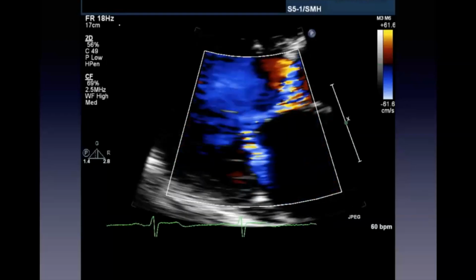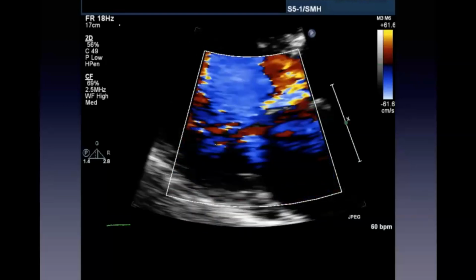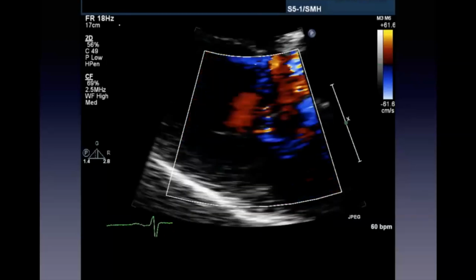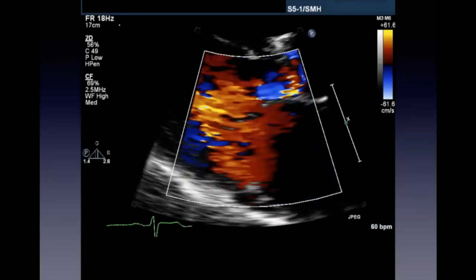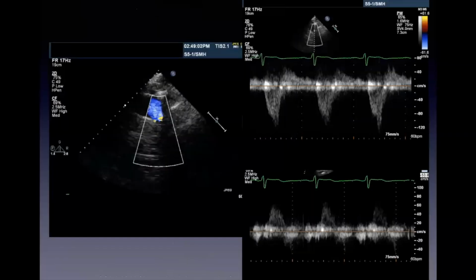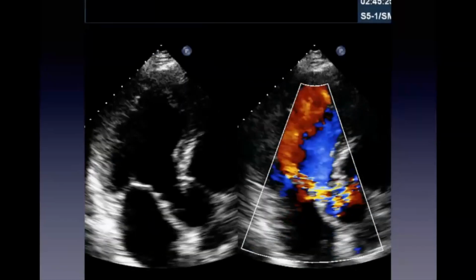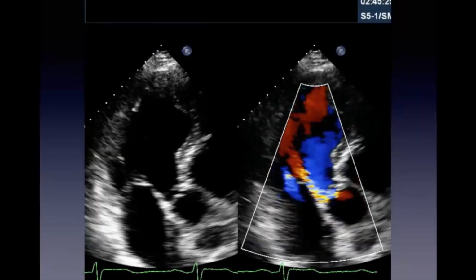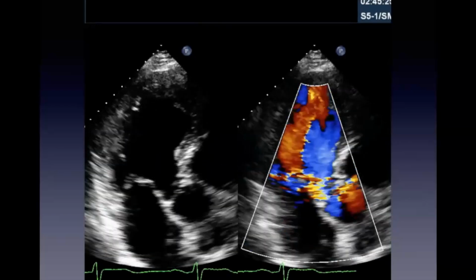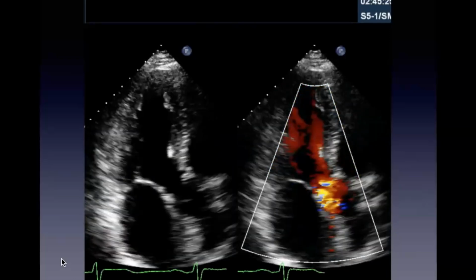So what does diastolic mitral regurgitation mean in this particular context? LVEDP is very high. Yeah, exactly. So this tells you that at the end of diastole, or somewhere during diastole, pressures in the left ventricle are now greater than pressures in the left atrium. And in this case, it's because of the aortic regurgitation. And actually there was a hint. You saw it best here, but even here, a lot of times you're so focused on that AI that you say, oh, there's trace mitral regurgitation. But the MR here is in diastole, because you can see the aortic regurgitation. All right.